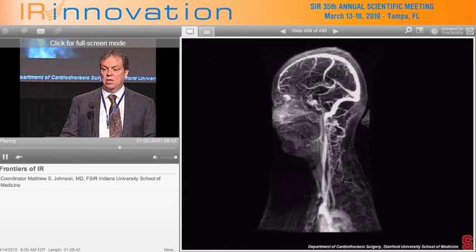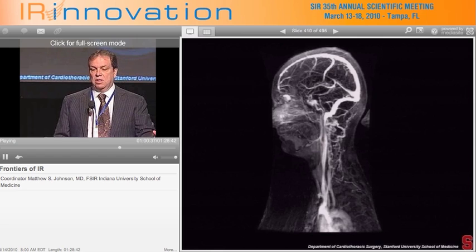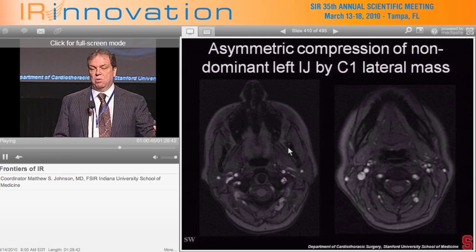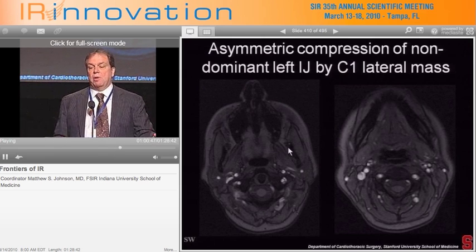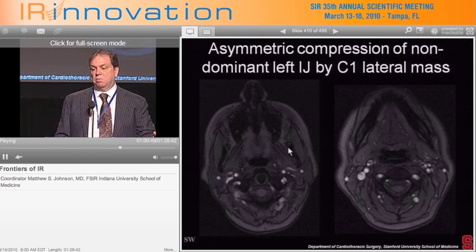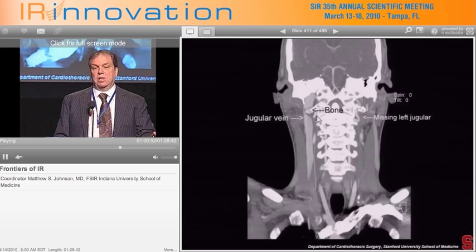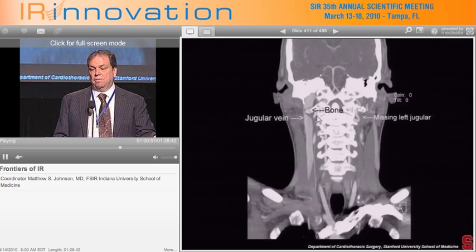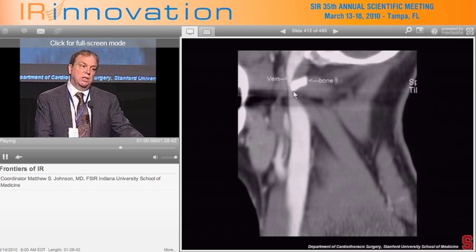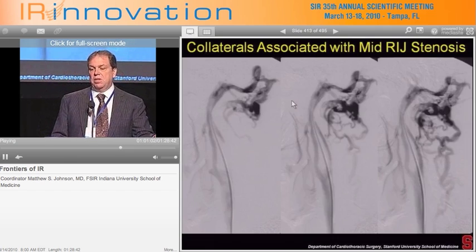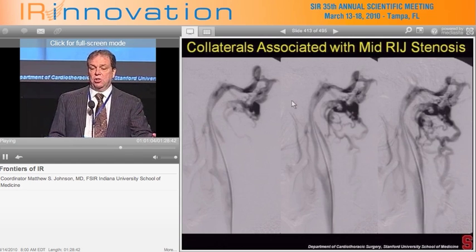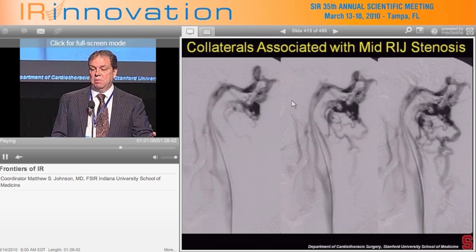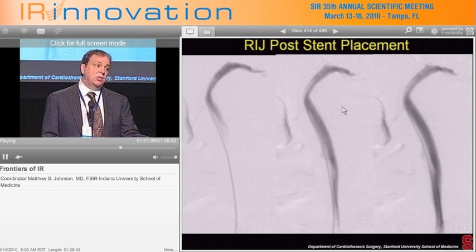Could it be valvular or in another location? Could it be azygous? Here you can see flattening of the jugular vein on the left versus the less flattened jugular vein on the right, sitting right on C1 — the most prominent transverse process — with more normal appearance below. On CT scan you can see the jugular vein encroached by the transverse process of C1. This patient looks much like that assaulted youth, and this is an MS patient before and after stenting.